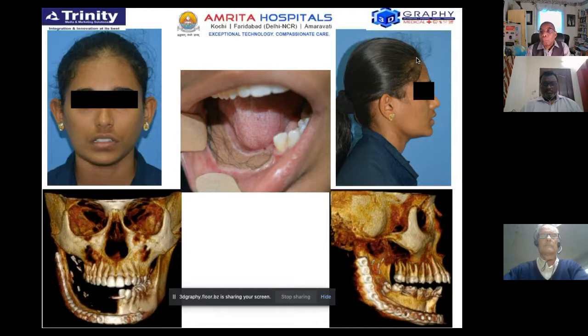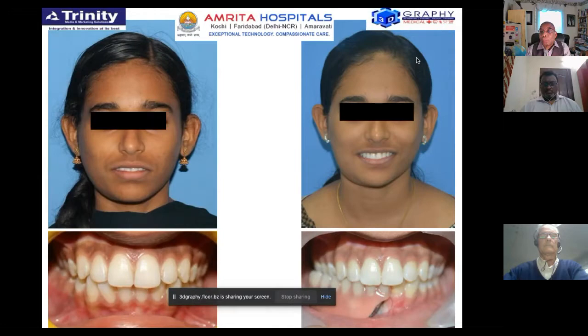Everything looked very good. But the implant positioning and the loss of vestibule were a very big concern for us. But if you look at her, she looks good. She doesn't look like she's been operated on because of the facial symmetry. Everything is nice. But then when you take a scan or an X-ray, you find the bone in a very different position.